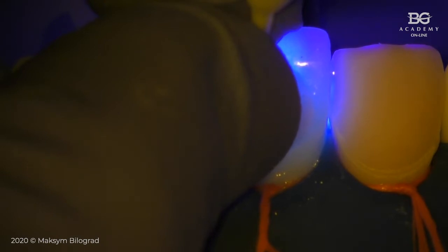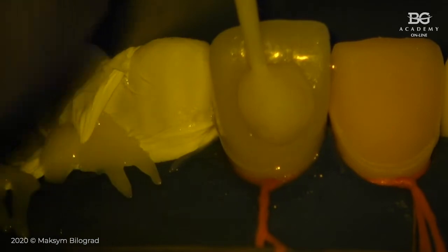You can see that the light goes through, and the power of the lamp is decreased by the thickness of the tooth, and the light that gets into the surface of cement is making so-called soft polymerization. This way we decrease stress on cement. So this 20 seconds is enough to stabilize your veneer completely.